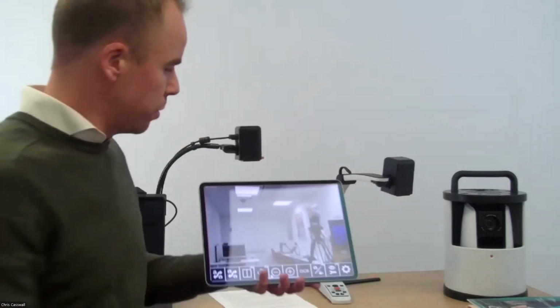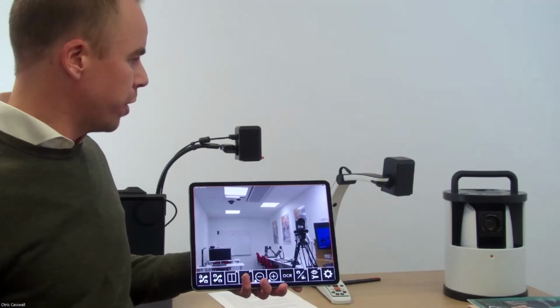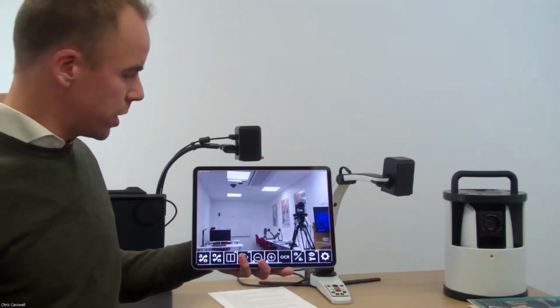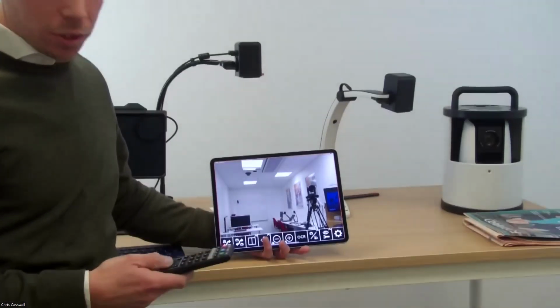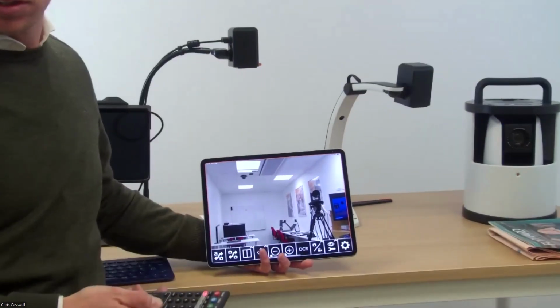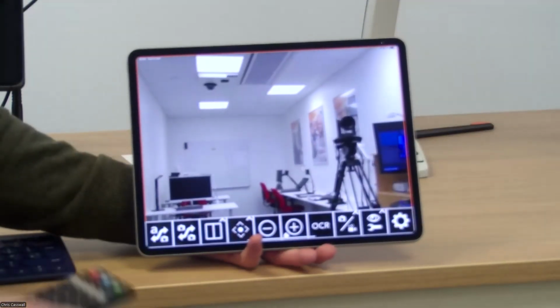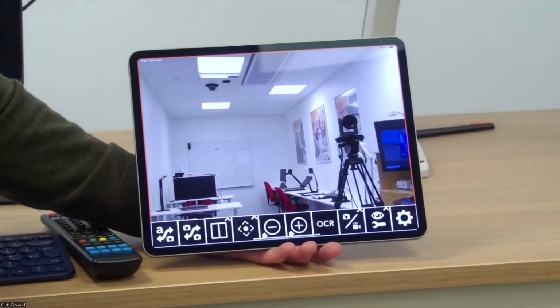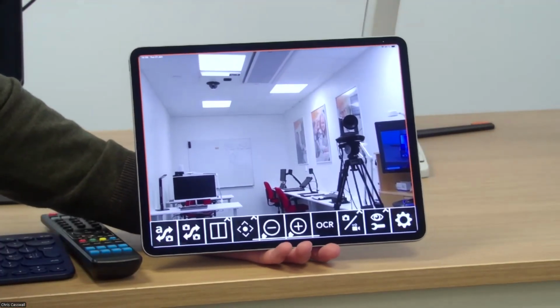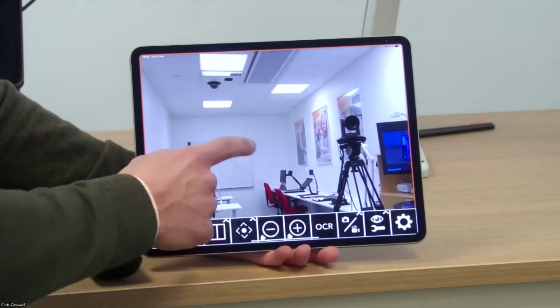So I'll come over to the other side. I'm standing about 3 feet away now from the camera itself. It's kind of next to me here on the desk. And then I will have you come in a little closer on the screen. There are a couple of ways to control the software and its features, meaning how to control the cameras.